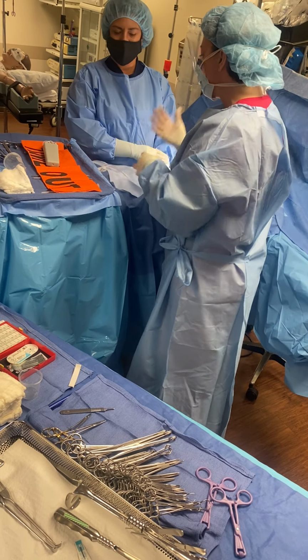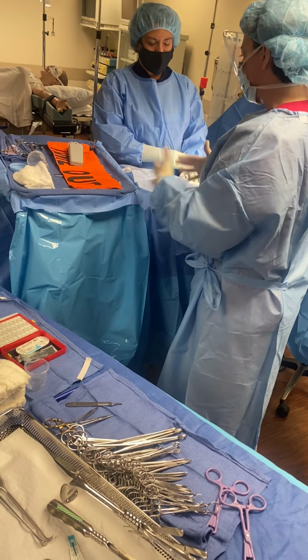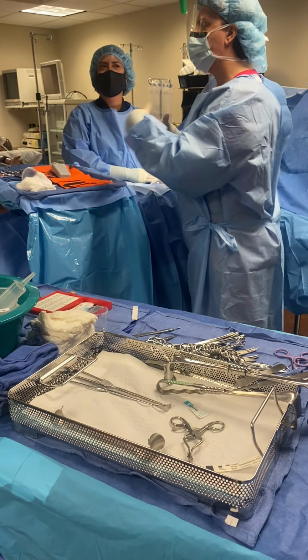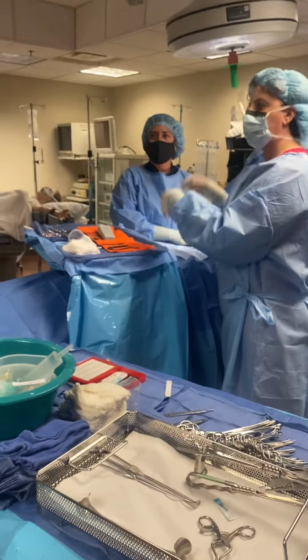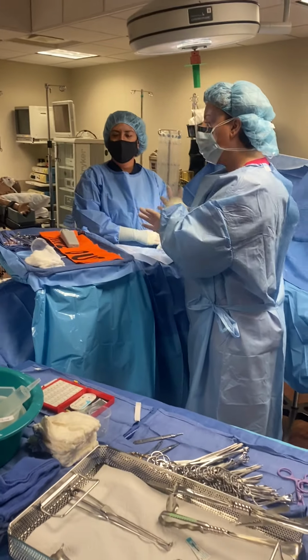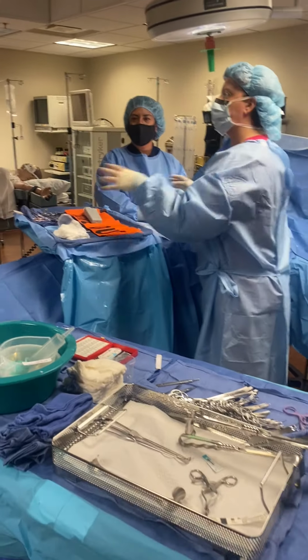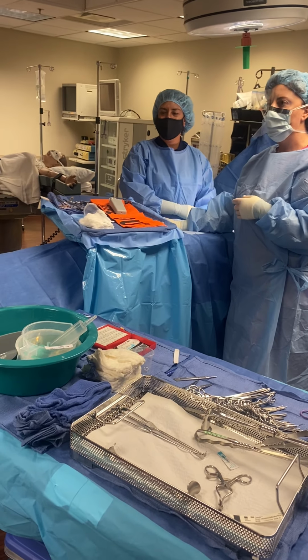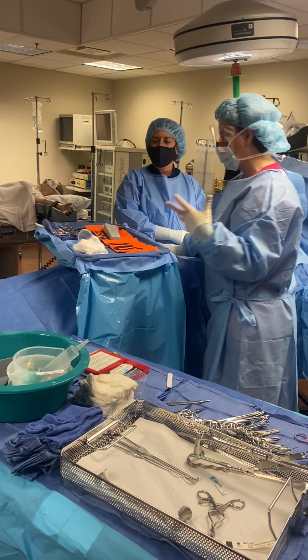And when you're new and you're working with cords, this seems pretty simple and straightforward, but they do have a tendency to get away from you. So put one and attach it, put another and attach it. Once you get skilled in it, you can throw off 10 cords and manage them while you're managing it here. But at first it's kind of squirrely, all right?